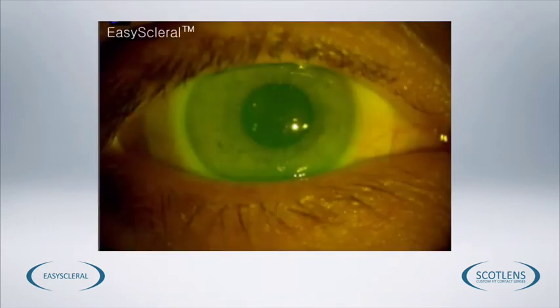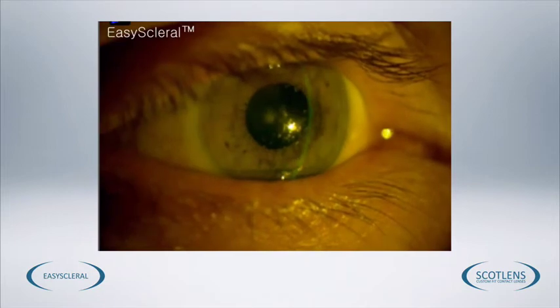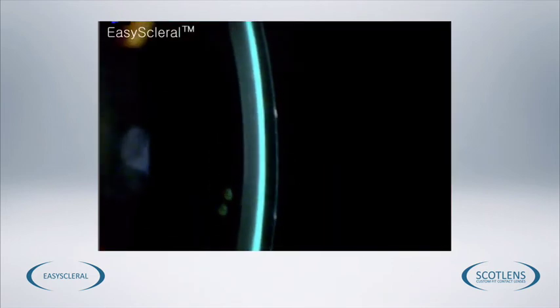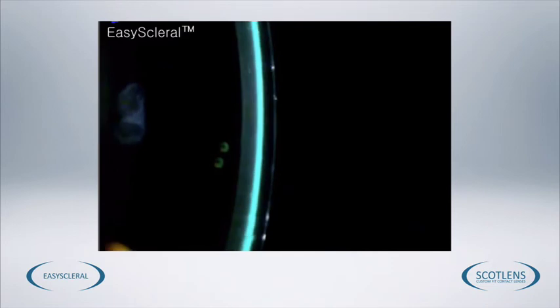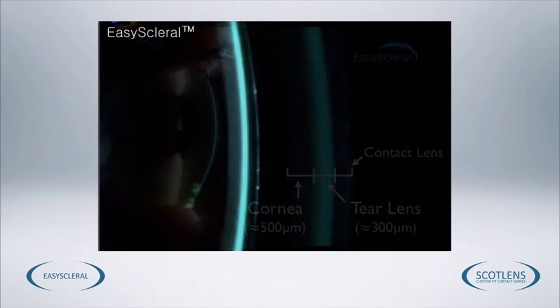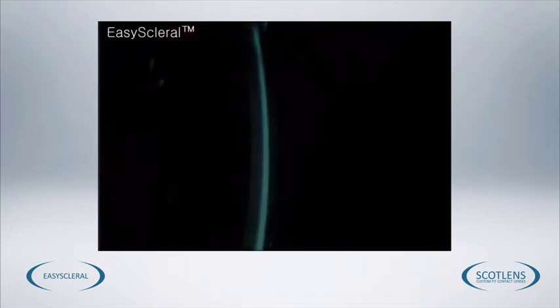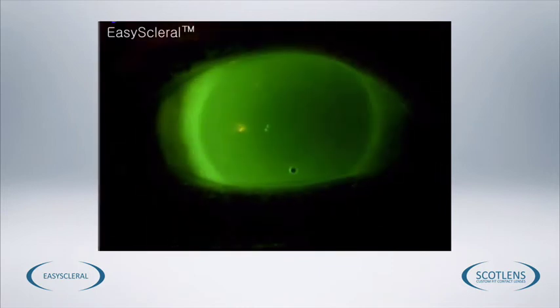So to assess this, we want to bring our viewing system round to about 45 degrees, have a bright, narrow section view so we can assess the cornea, the tear lens and the contact lens. So here we can see that the tear lens and the contact lens are about the same thickness. Now the contact lenses are supplied at 300 microns thick, so in this image we can see that the tear lens is also 300 microns thick. And this is the optimum amount of apical clearance that we want to achieve.